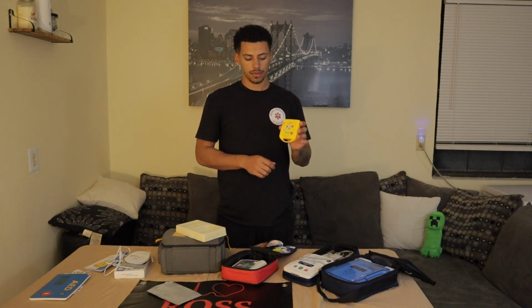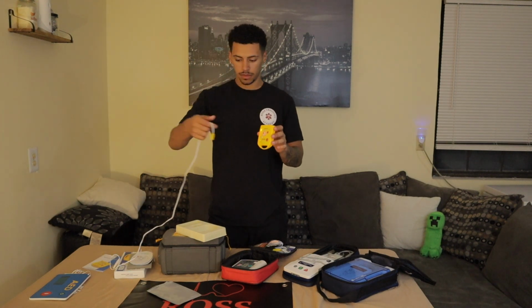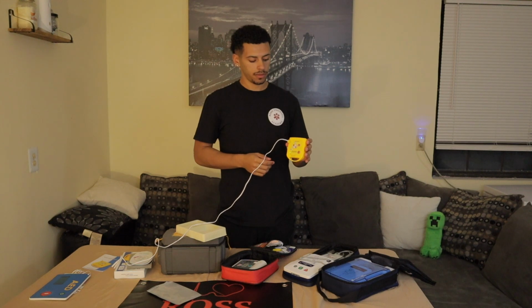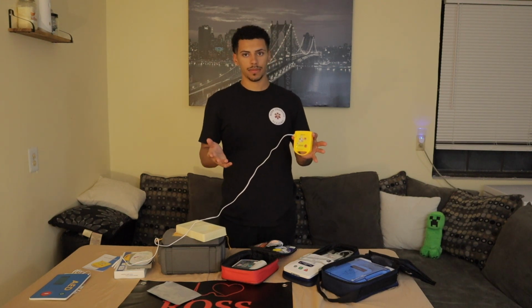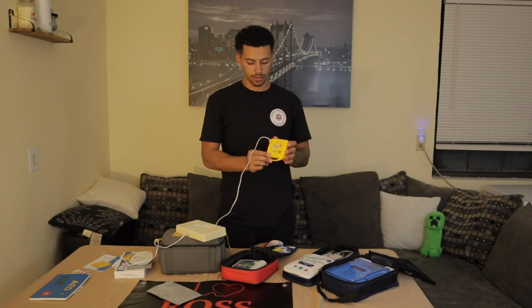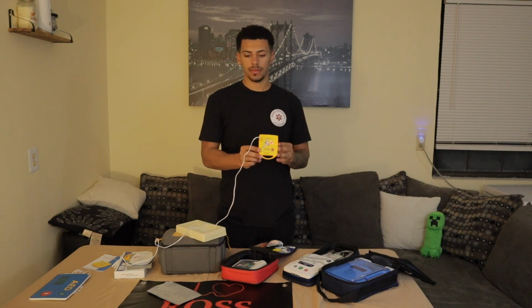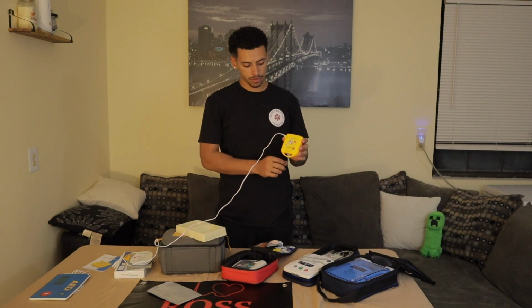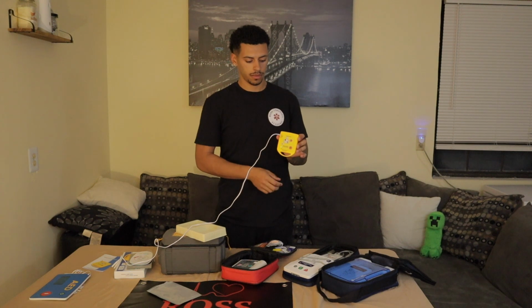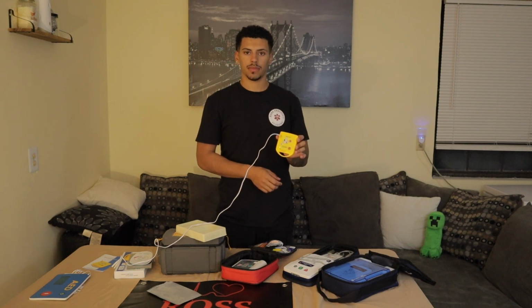Apply pads to patient's bare chest. Plug in pads connector next to flashing light. Analyzing heart rhythm. Do not touch the patient. Shock advised. Charging. Stay clear of the patient. Deliver shock now. Press the orange button now. Shock delivered. Start CPR.